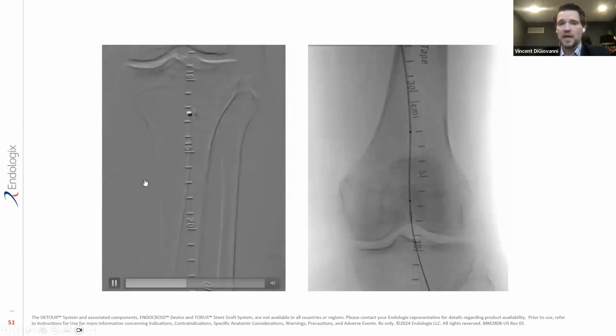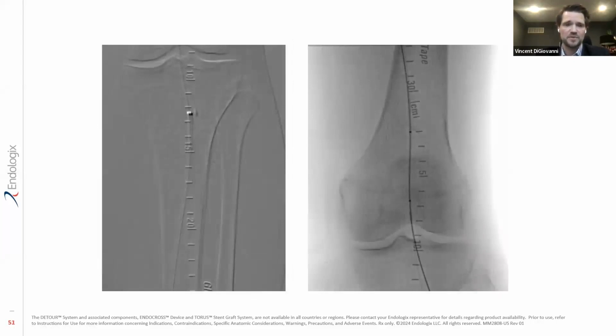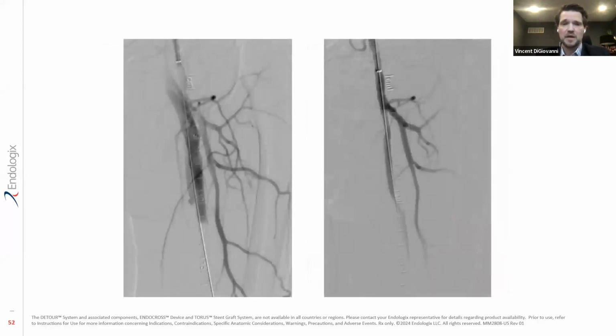So once we get our 018, or excuse me, our 014 wire down into our distal circulation, and we've done our initial ballooning, we're going to advance a tandem catheter down into your distal arterial circulation, get a tibial picture, and make sure that what you're looking at is in fact arterial. Ask me how I know that you can get into the venous system and balloon the venous system, because I've done it in the past. Thankfully, there's no long-term sequela, but it can happen.